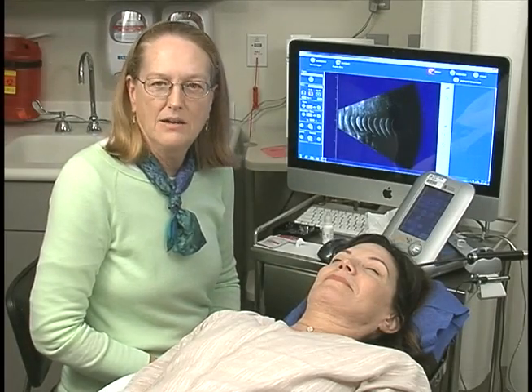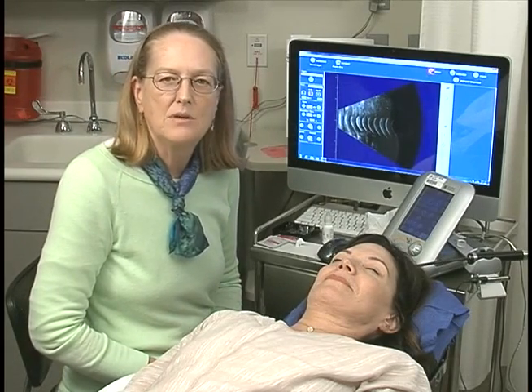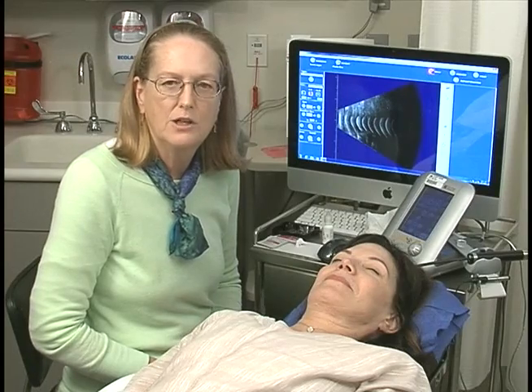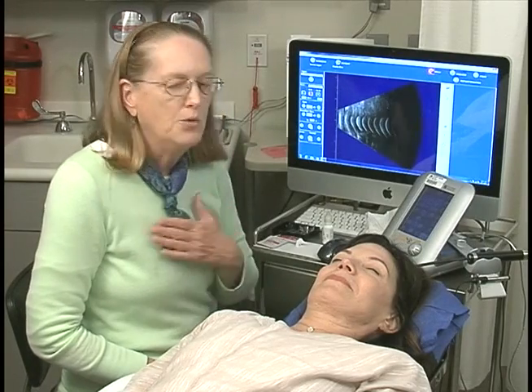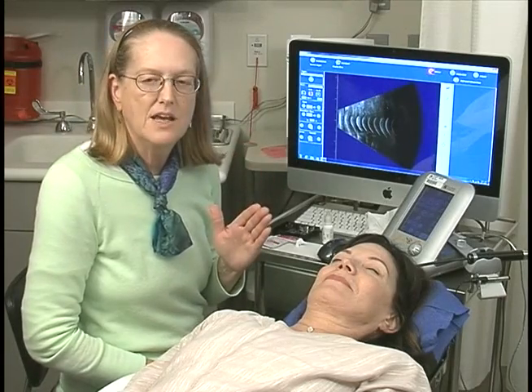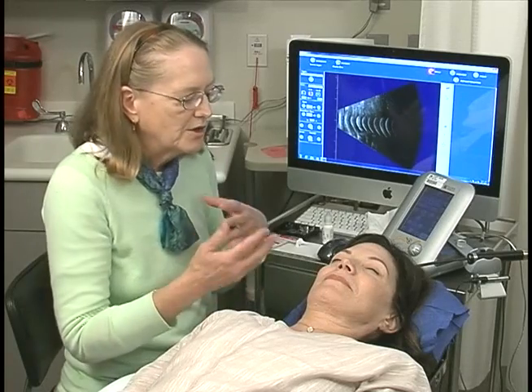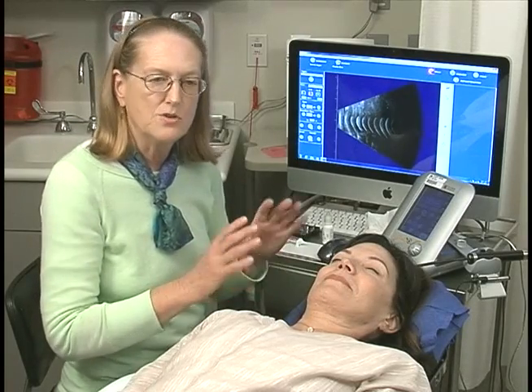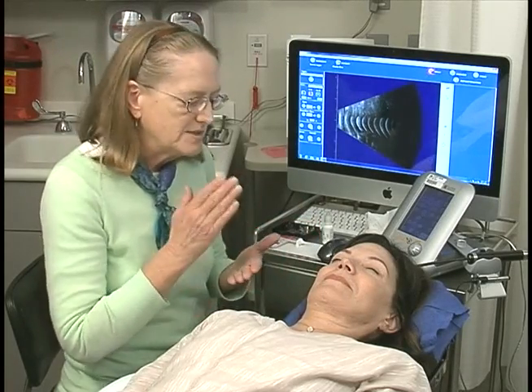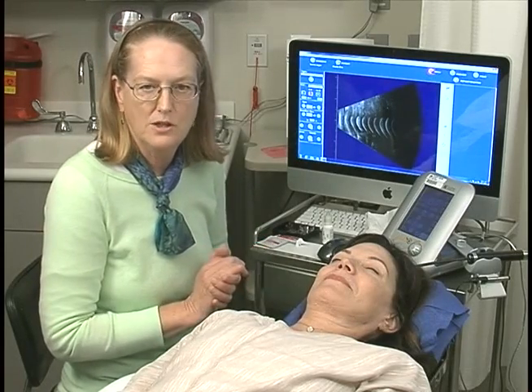The most important part of any ultrasound examination is to know that you are confident that you examined every aspect of the globe and the orbit. The only way to be that confident is to have a systematic exam performed in the same way on every patient every time. We have specialty techniques for special situations, but the systematic exam will ensure a thorough examination of the globe and orbit.